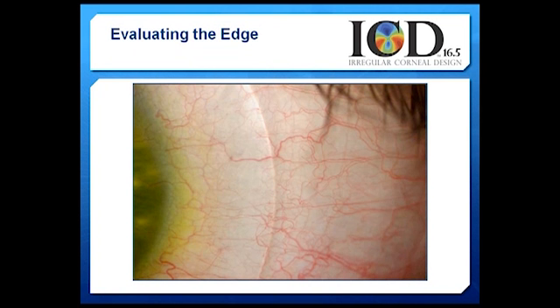Now the last zone in the lens is the scleral landing zone. And what we're looking for is a lens that lands with 100% of its weight and pressure out on the sclera. We want the lens to spread its bearing throughout the conjunctiva where it lands and create a soft, distributed amount of pressure.